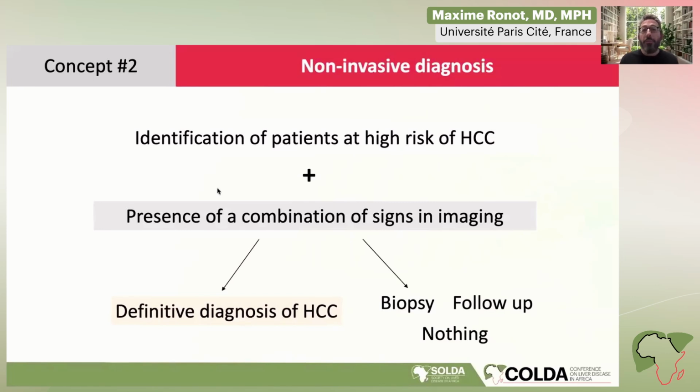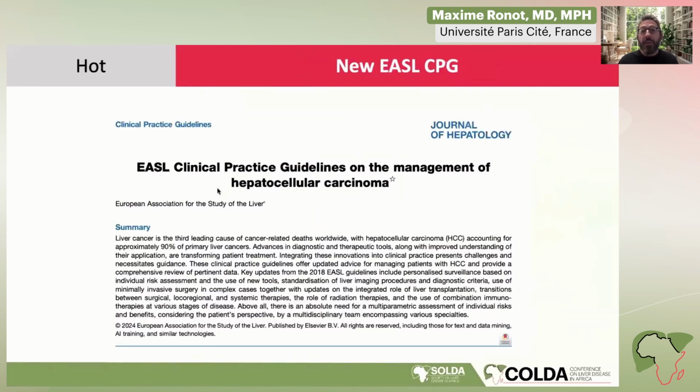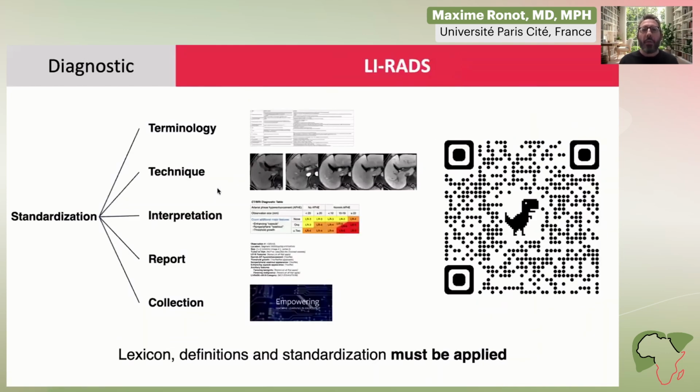Now, this is one of the things that is very much present in the EASL guideline, and the very recent update of these clinical practice guidelines reinforces the strength of the non-invasive diagnosis, but changes a little bit the way it should be done. And the change is based on the endorsement of the LI-RADS system, the Liver Imaging Reporting and Data System coming from the American College of Radiology.